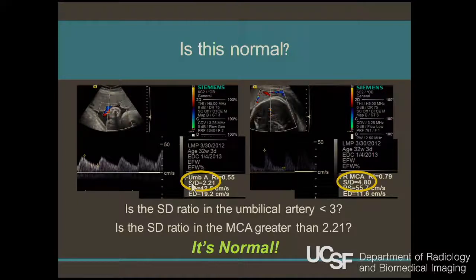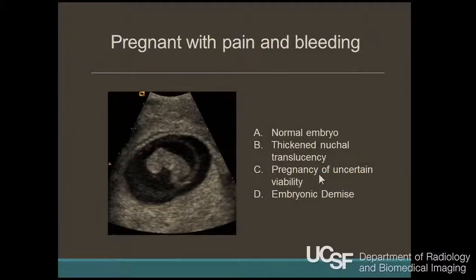It's usually that this is 3.6 and this is still 4.1 or something like that. It's only when this gets to be high that this will start to drop below it. But when you start to see that happen, the baby is really in trouble because the brain is starting to get affected. So this is something that can be very easily incorporated into your practice, it's not complicated, and can be really helpful to the obstetricians.